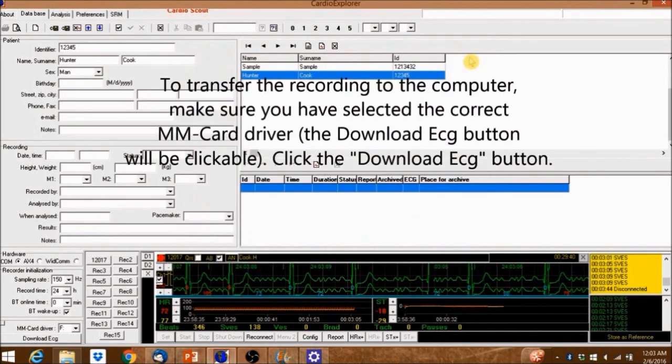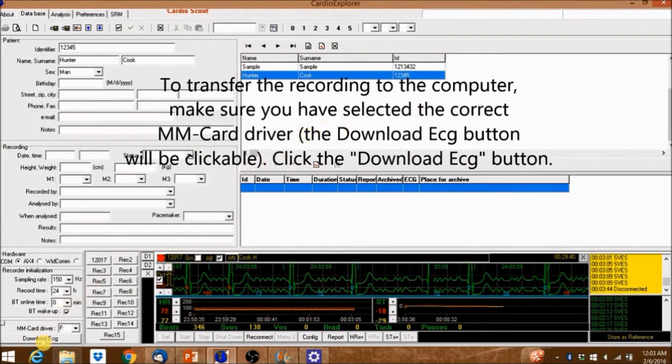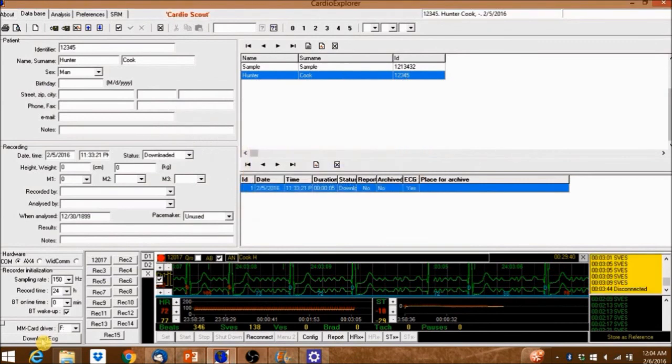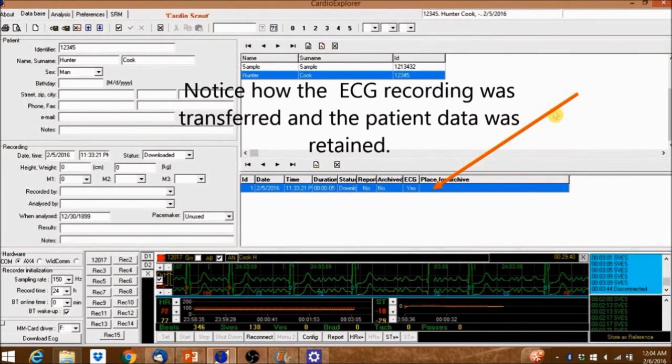To transfer the recording to the computer make sure you've selected the correct MM card driver. The download ECG button will be clickable. Click the download ECG button. Notice how the ECG recording was transferred and the patient data was retained.